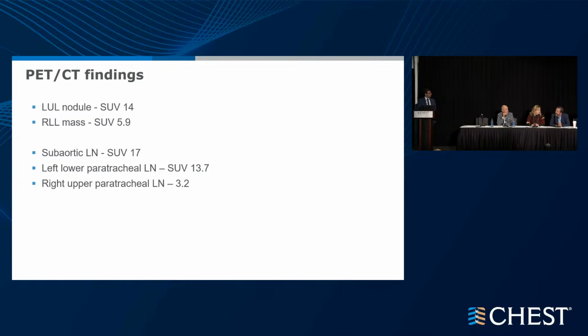What I think is really interesting about this is, if the right-sided lymph node shows tumor, I don't know if I believe that belongs to the right lower lobe subsolid nodule. Not very hot. How often do we see a 2R being involved with cancer from lung cancer per se? It's usually from upper lobe cancers, and you would expect a mass, not a ground glass subsolid nodule. So if 2R ends up being cancer, I very likely intra-procedurally think of this as a 3B from the left, and then address the right separately.